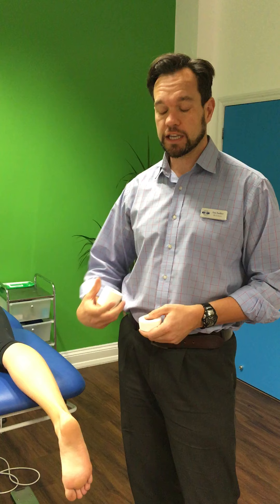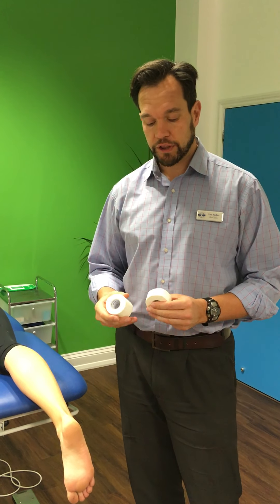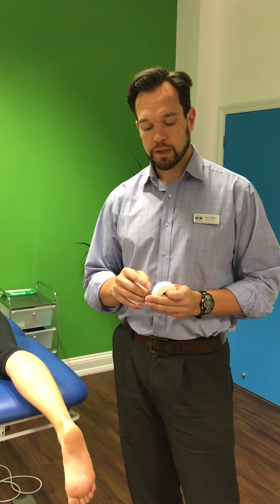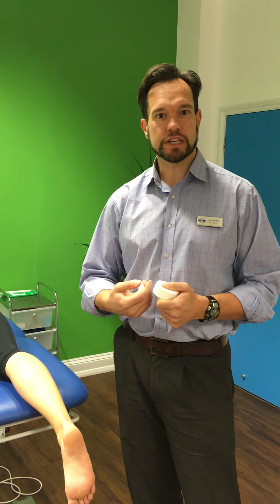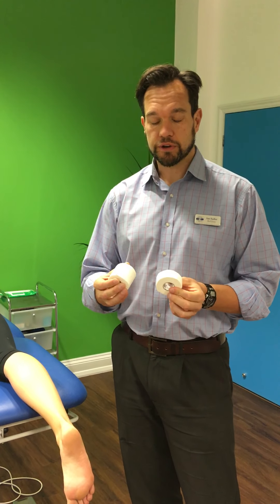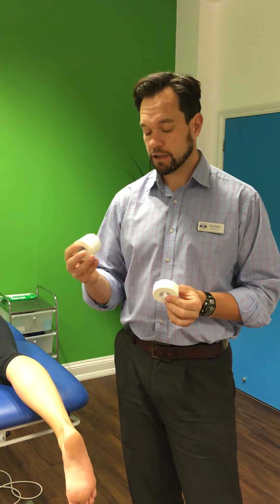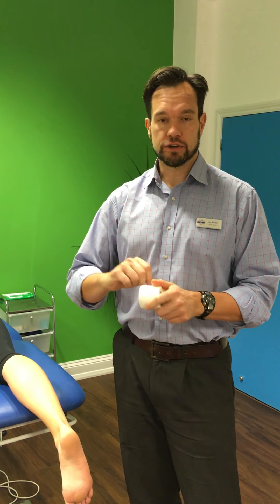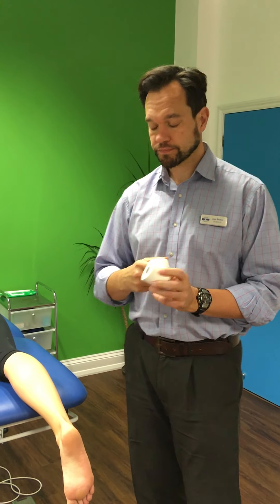For this taping we're going to be using zinc oxide tape. It's quite a stiff tape — I think of it like a bed sheet with some sticky on the back. Ideally you have two sizes: two-and-a-half centimeter and five centimeter, but you can get away with just the five centimeter because you can tear it into parts.